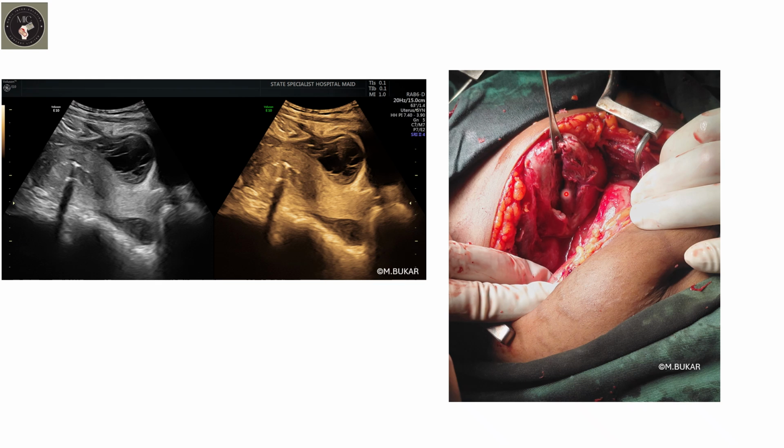So in this video, we are able to show how to differentiate clean from dirty shadow, and the dirty shadow in this case is a result of the perforation and also the infection, probably with anaerobic organisms. So this can actually explain the dirty shadowing in this case.